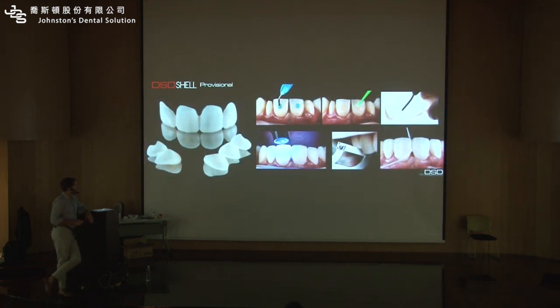Okay? So if it's a mock-up, we don't need to glue. It's in and out, 10 minutes. Same appointment we remove. Motivational mock-up. If it's a provisional, you can spot etch and bond. And it becomes a provisional.